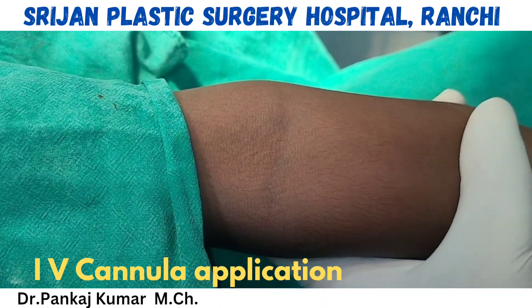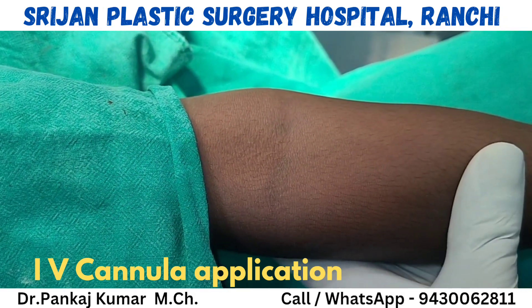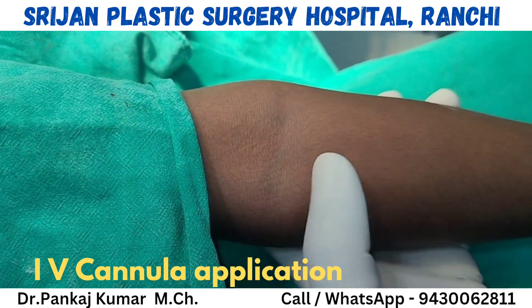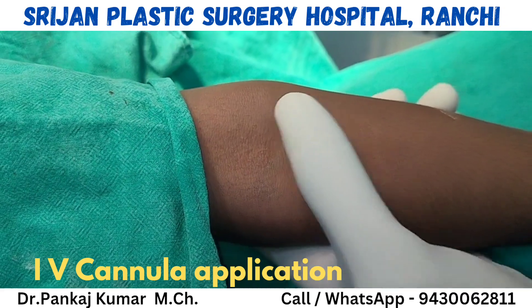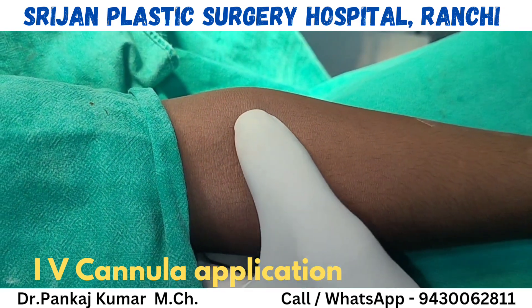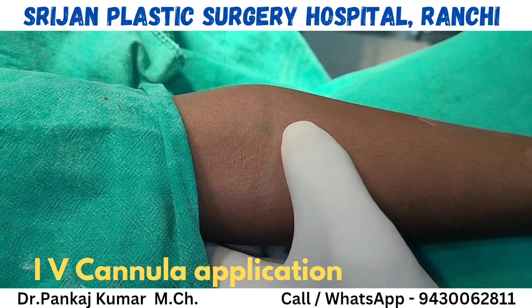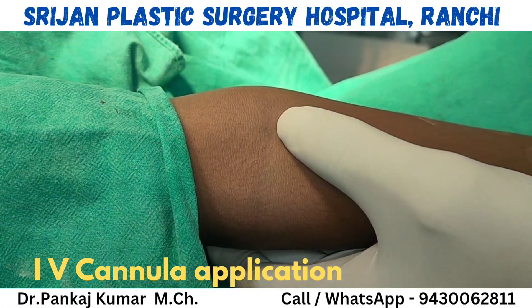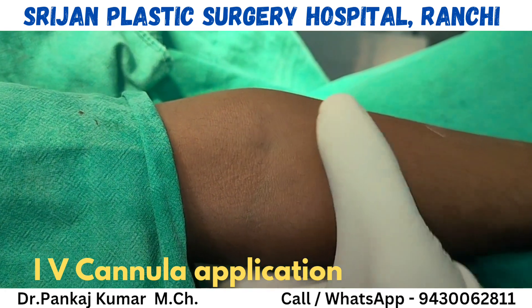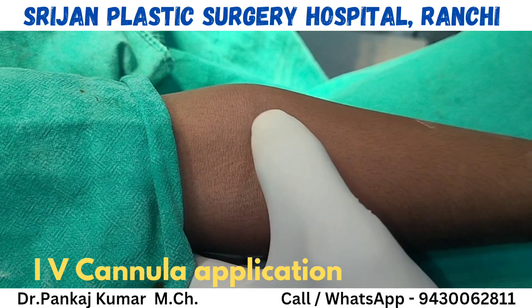We are going to establish an intravenous line in a 10-year-old boy. The most important thing is to identify a suitable vein. The veins are barely visible, but visibility is not important — palpability is. You can identify the vein by palpating with the tips of your fingers. Here we can see some blue structure, but on palpation I am able to find the length of the vein. Palpation is important — the vein should be felt, not just seen.